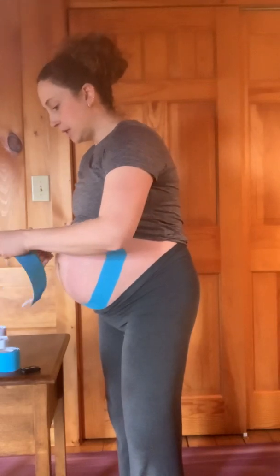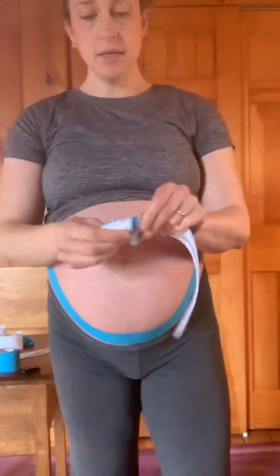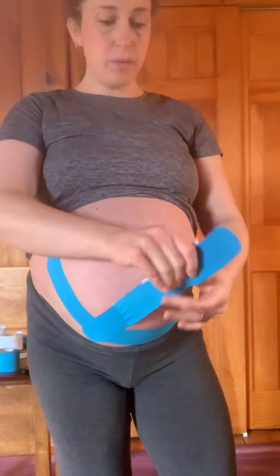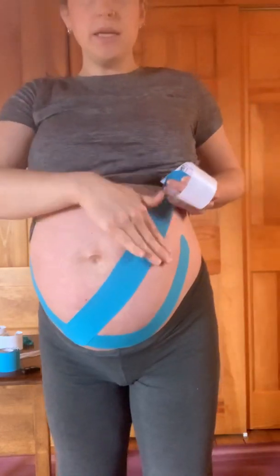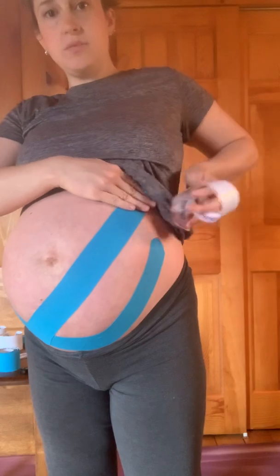I'm just rounding the edges here again. For these two pieces, you're going to take just the end, peeling it off and pulling the paper down just a little bit. I'm trying not to reposition my fingers if I've touched the adhesive. Come down low on the belly, right about here, overlapping with that first strip. Get that heat activated, then peel the paper off almost towards the end, coming under the belly button and across. I've got tension from about here to here, and then that last little bit, no tension — just lay it down flat.